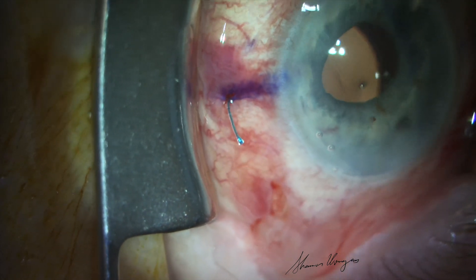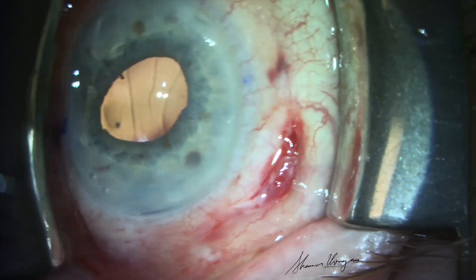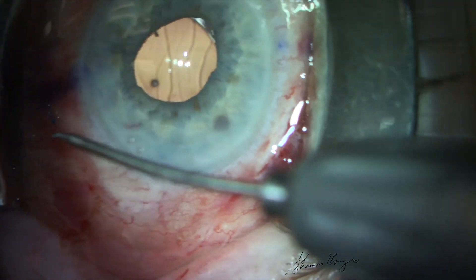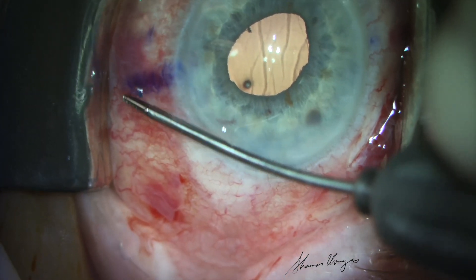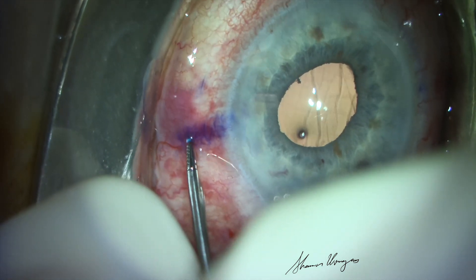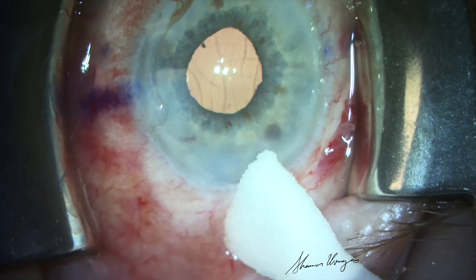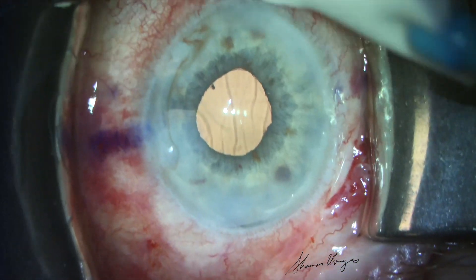The 3 o'clock haptic has been wedged into the sclera by the natural movement of the eye. The 9 o'clock haptic is then placed into the sclera below the conjunctiva. Both terminal bulbs of the haptics are confirmed to be below the conjunctival surface. The optic is well-centered and this is the appearance of the eye after successful intrascleral haptic fixation.